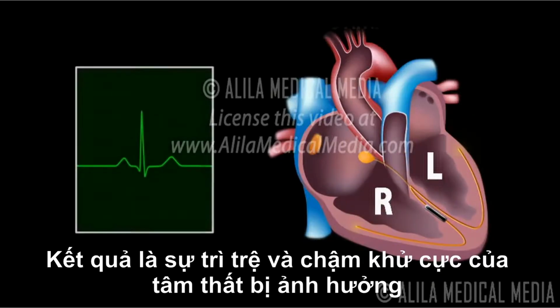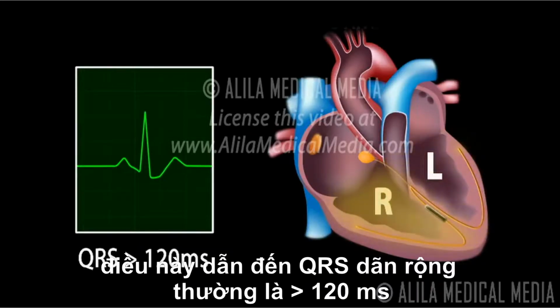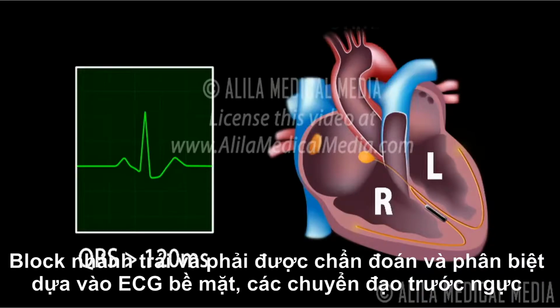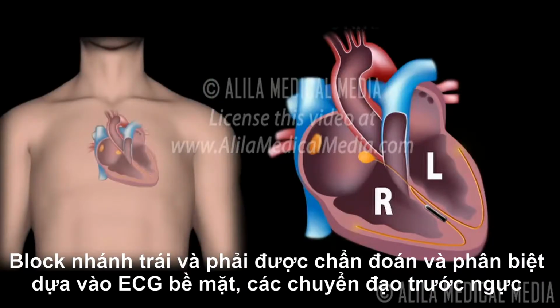This results in a delayed and slowed depolarization of the affected ventricle, hence a broader QRS complex, typically longer than 120 milliseconds, and a loss in ventricular synchrony. Left and right bundle branch blocks are diagnosed and differentiated by looking at ECG recordings obtained from the chest leads, which register signal movements in a horizontal plane.